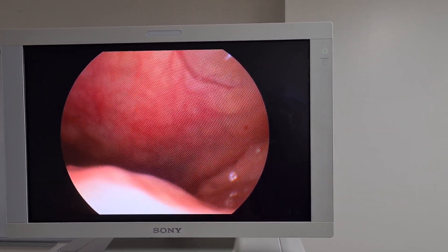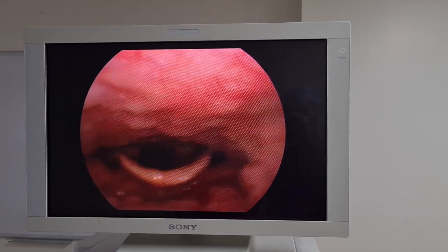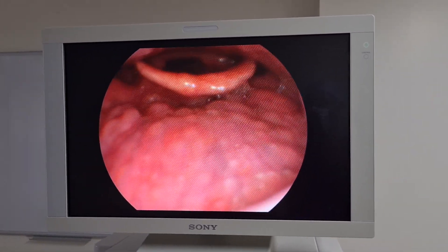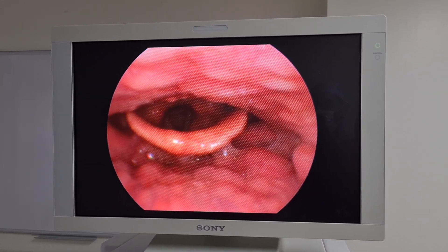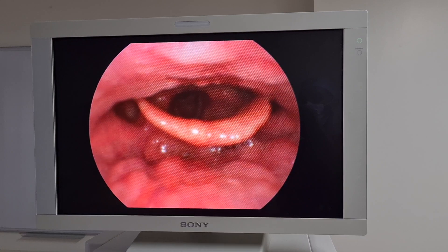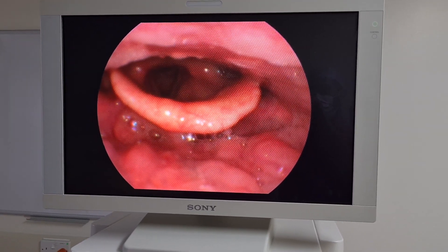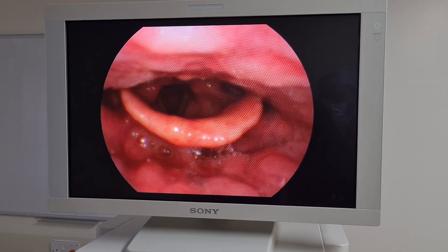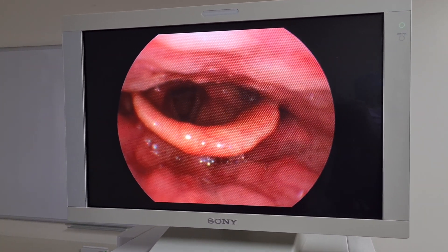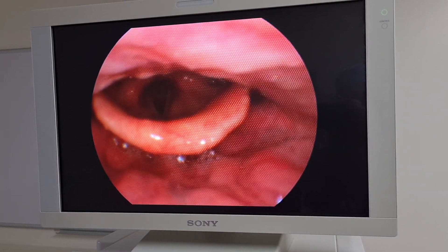Nice deep breath in, Dr. Ringrose — we're just going to slide it in again. If it's uncomfortable, let me know and we'll stop. Our view starts to change a little bit. At the bottom of the picture, this is the tongue base and the follicular tissue. And that is the epiglottis — this cartilaginous structure in the middle of the picture. As you can see, the vocal cords are moving there. Just to orientate ourselves: the bottom of the picture is anterior to the patient. This picture is now laterally inverted, so the right of the picture is the left of the patient, and the left of the screen is the right of the patient.